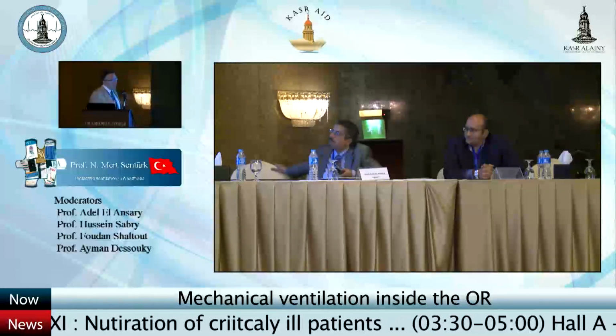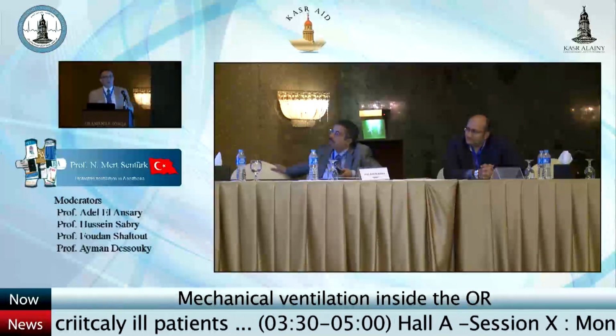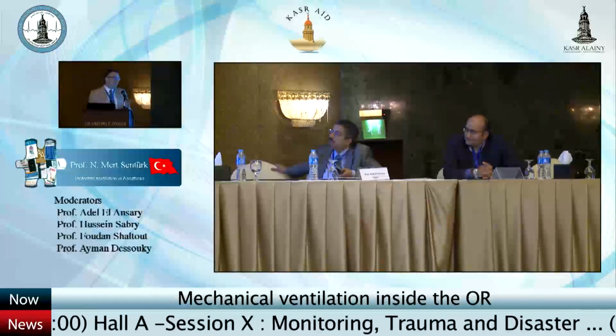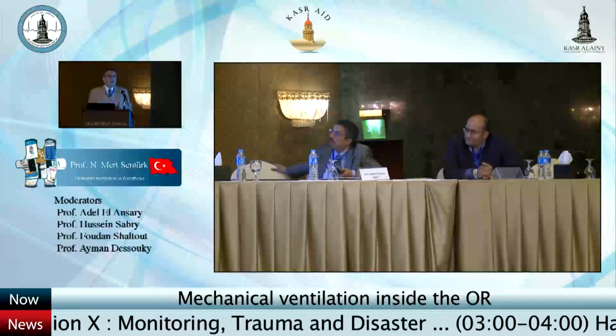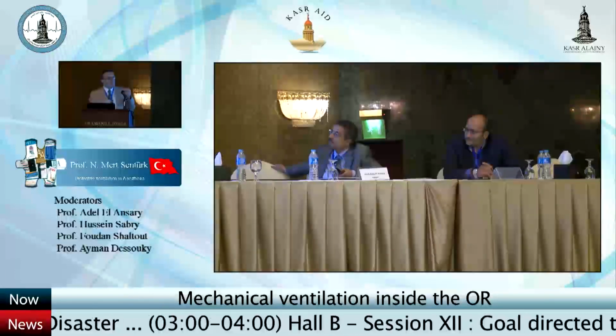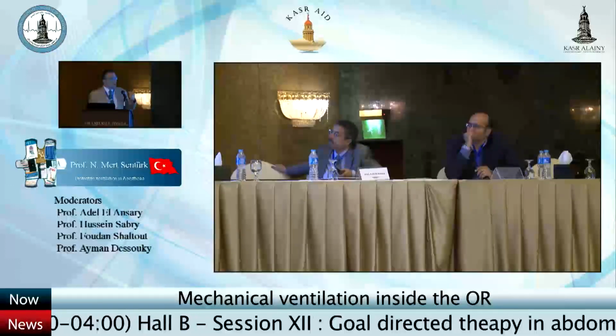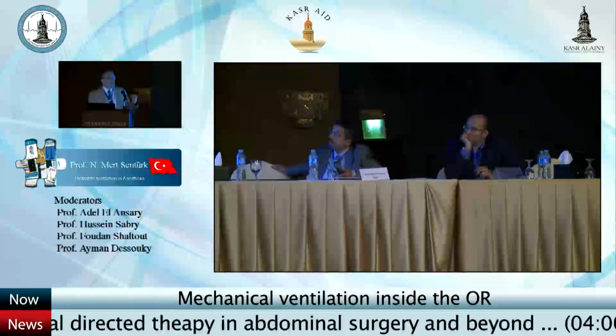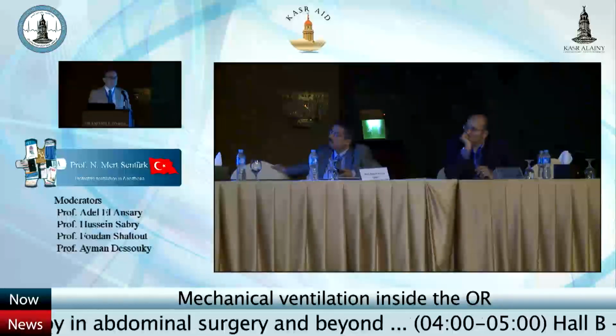And the more the flow, the drier and the colder. Therefore, there are also some studies showing that the clearance of the mucociliary activity is decreased, but you cannot say that this is the evidence.